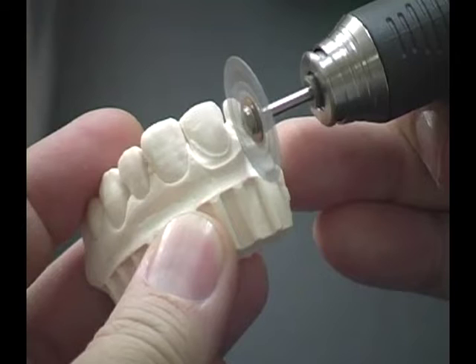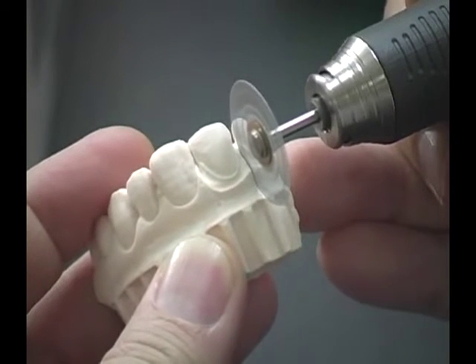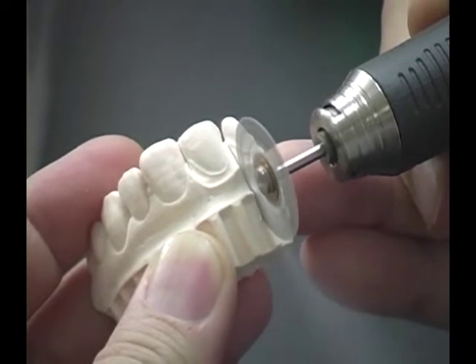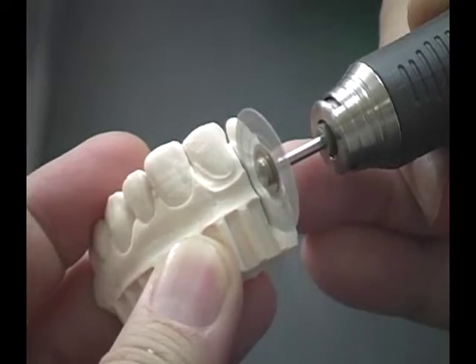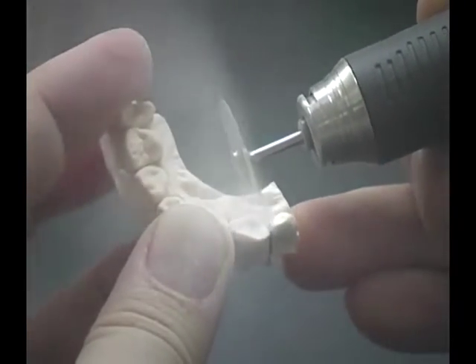First, use the Sinta Disc, an extremely thin sintered diamond disc designed to separate the die from the working model. This ensures that the margins are intact for fabrication of the veneer.